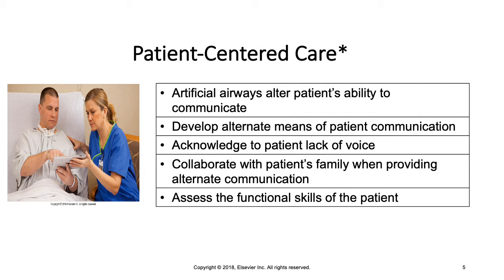So just be mindful of those things and be patient and take time to explain things to your patient. Another thing that you want to do is make sure that you perform a functional assessment. So if we're using alternative means of communication, head shaking, nodding head yes or no is really simple, but in the image you can see the nurse is using some type of iPad, some type of tablet to communicate.